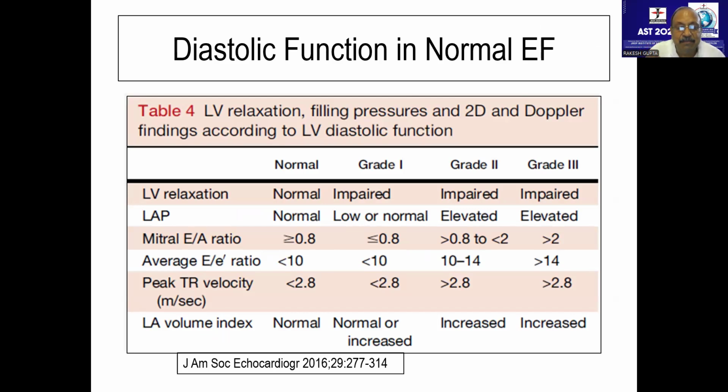Over a period of time, the patient will start struggling to hold his breath. That is what Valsalva is. Tomorrow, very simple: go to the 4-chamber view, put a sample volume at the mitral valve flow. Wherever you get a perfect sample volume, ask the patient to hold his breath and gradually he will go into Valsalva automatically.